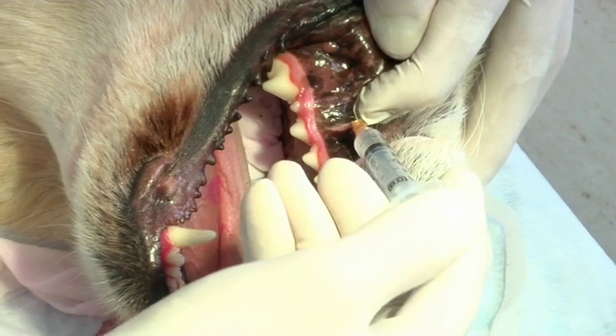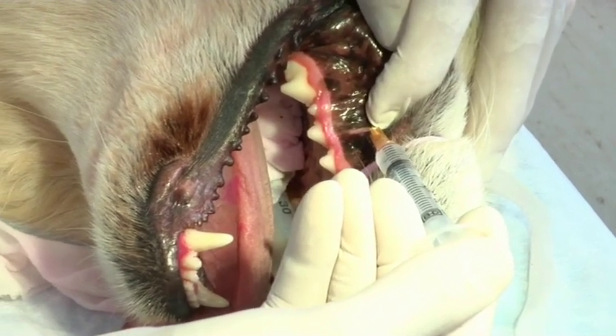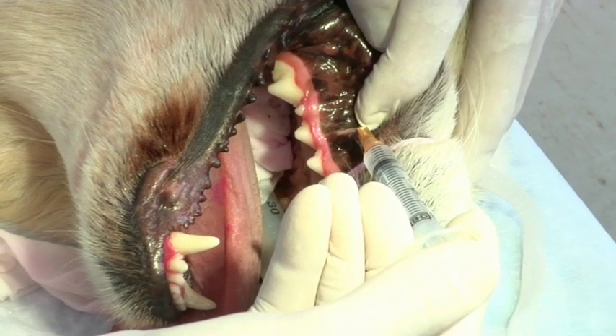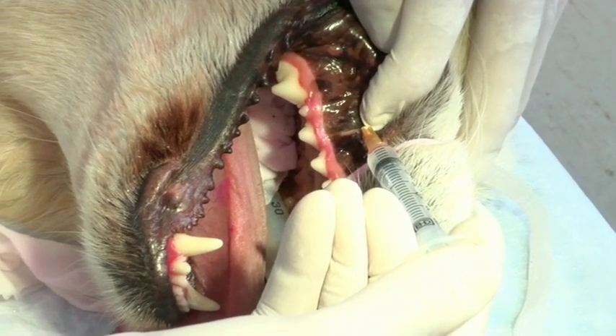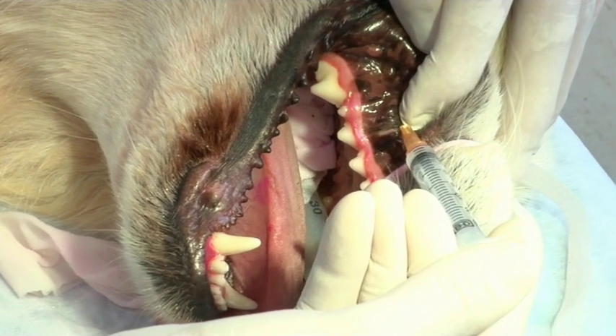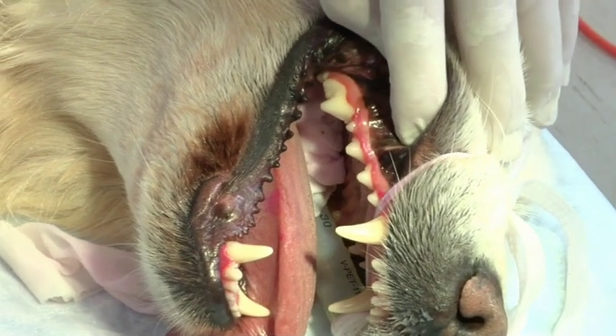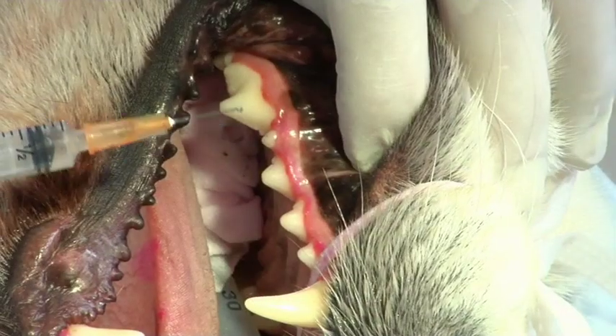The infraorbital foramen is usually level with the distal root of the upper third premolar. Finger pressure is applied to the foramen whilst injecting, and also once the needle has been removed — this will allow for infiltration of the local anesthetic agent along the canal.